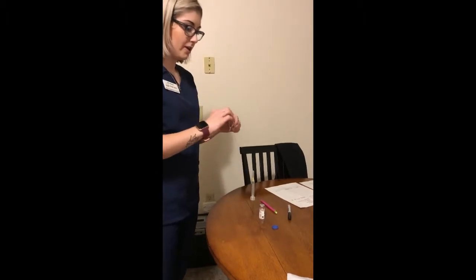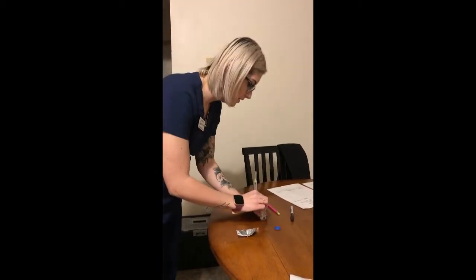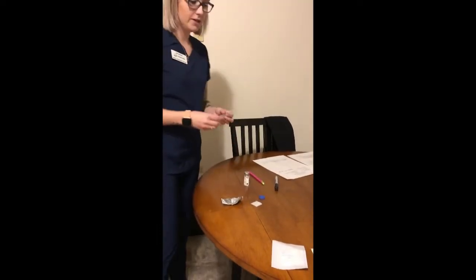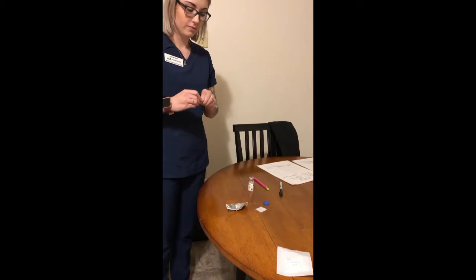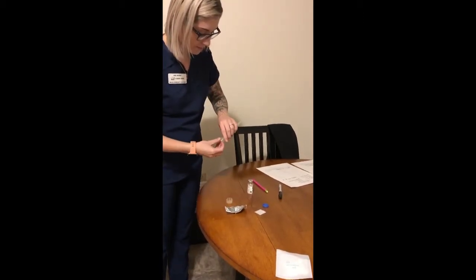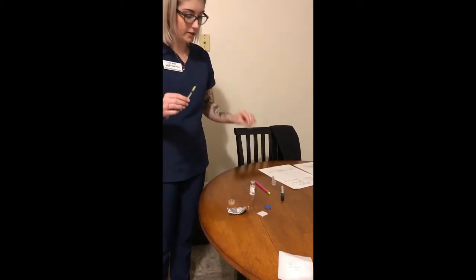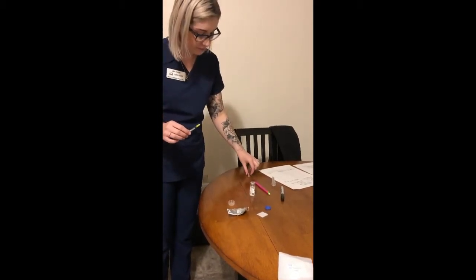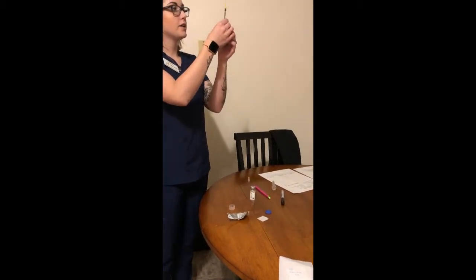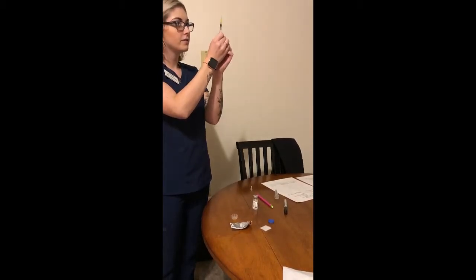open up an alcohol swab, clean the top of it, and I'm going to pick out my needle. I'm going to put the needle cap on a clean surface. I'm going to draw in 0.1 milliliters of air.